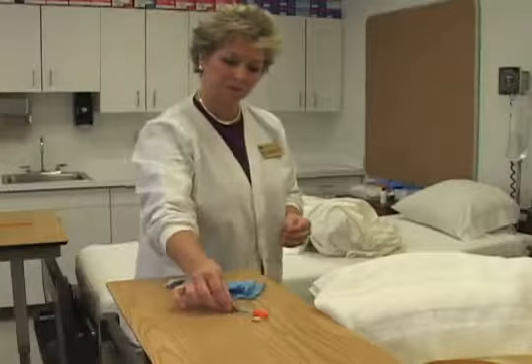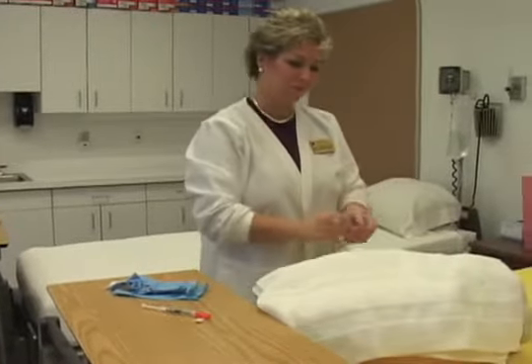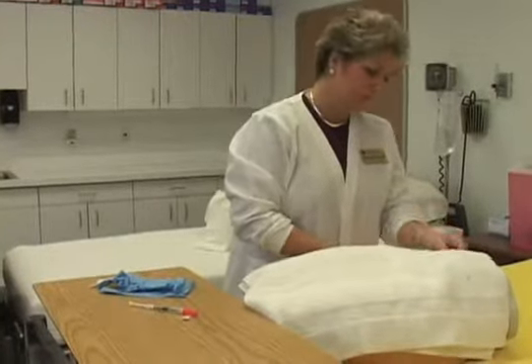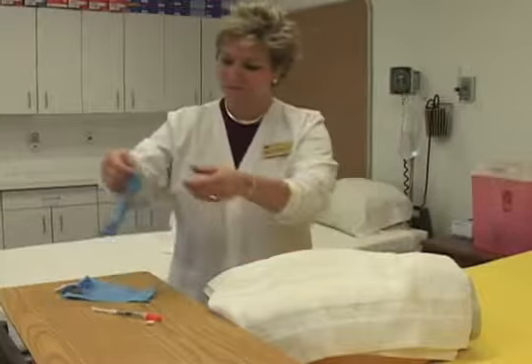At the patient's bedside, perform hand hygiene. Verify correct client. Explain procedure to client. Apply non-sterile gloves.